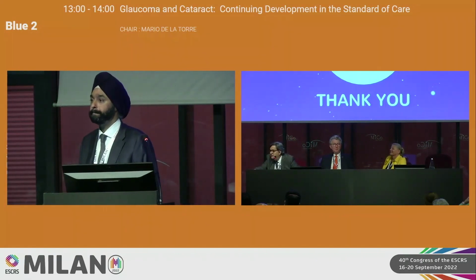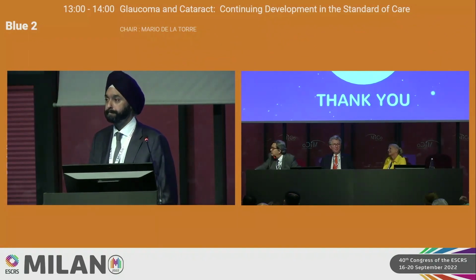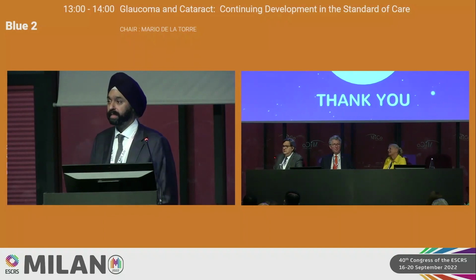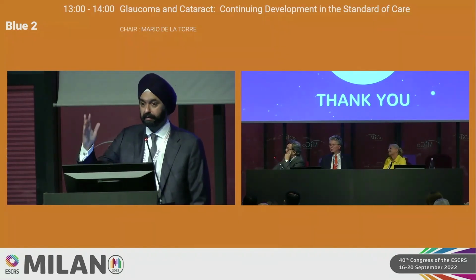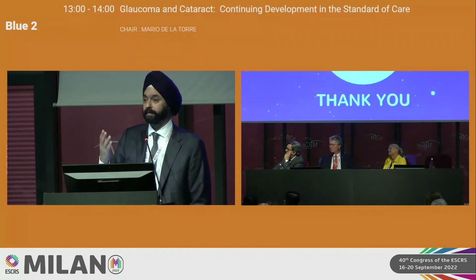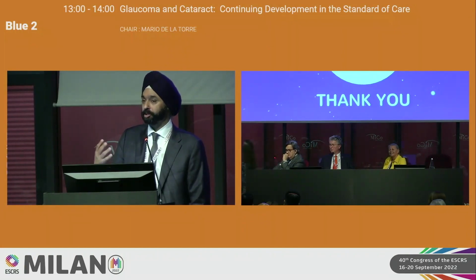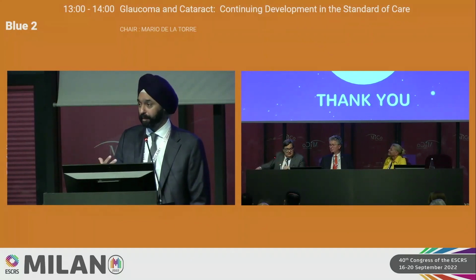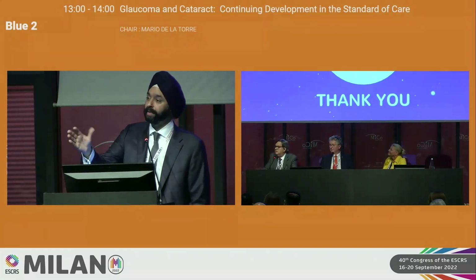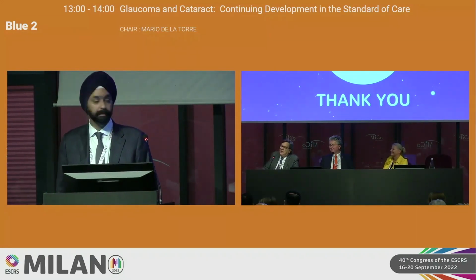From a corneal perspective, what do you see the role of SLT in patients who've had corneal grafts and the pressure problems that you can get from that? Is it effective in those situations? Sure. What's your experience? So the SLT and post DSAEK, DMEK, even PKs. Yes, it can be if you have the anatomy still good. Sometimes after a lot of these surgeries, the anatomy is not quite as good to see. But if you have a good TM that you can see, I think it's a great opportunity to get them off of any topical medication if you can as well. So depending on the anatomy, it's worth a try. Absolutely.